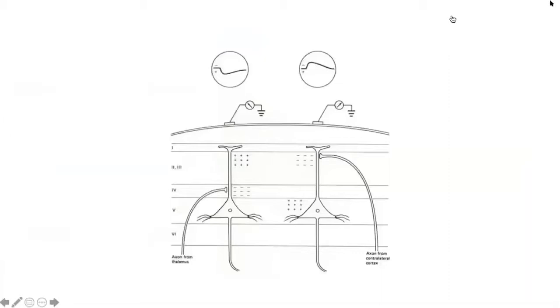This slide is helpful for some understanding as to what the EEG is, but it is also useful for some thought about what it's not. You can see the EEG is generated by neurons, and it's predominantly the pyramidal cells in layer 5. The electrical field that's generated on the scalp comes from a confluence of such neurons. So it's not one neuron generating one region. These are not potentials from the firing of one cell, but EEG really is the combination of many neurons together collectively, maybe 3 to 5 square centimeters. This is important going forward, as we get back to some of the basics of reading EEG: we're not looking at one small region of the brain, we're looking at large regions of the brain.